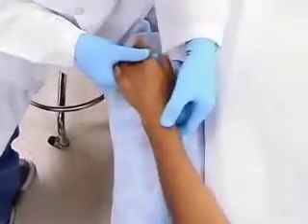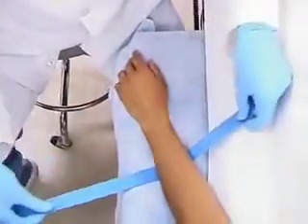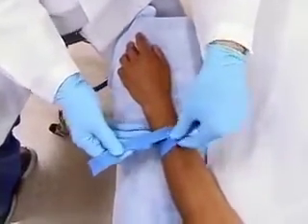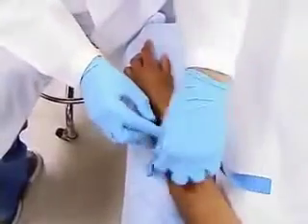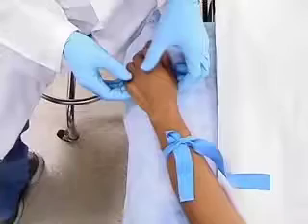Tie the tourniquet with a half knot 8 to 10 centimeters above the targeted insertion site. Place the tourniquet flat against the skin and bring the tourniquet ends together, overlapping one another. Stretch the ends of the tourniquet and with one finger, tuck the top tail beneath the bottom, directing the end away from the puncture site.